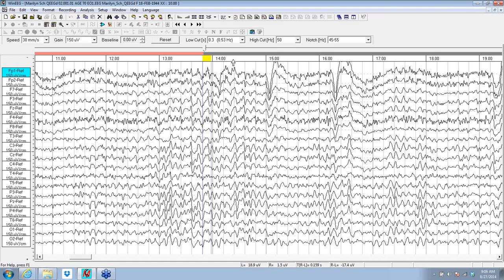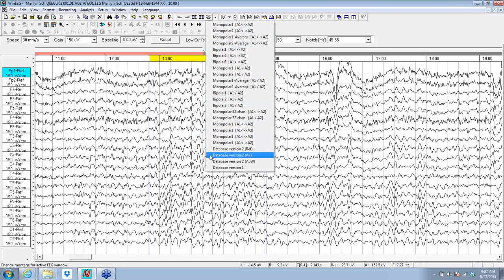And when we look at this widespread discharge, it looks like a lot of this stuff is taking a dip at the same time and making a bump at the same time, and that this isn't physically possible in the real world. So we know we've got something wrong with how we're looking at the EEG here. Our perspective can't be correct because this can't happen. But if we switch our perspective by changing our montage, we'll have a different look at this.